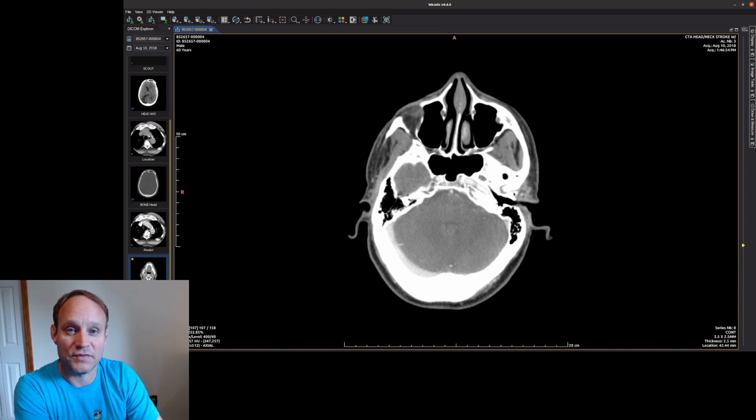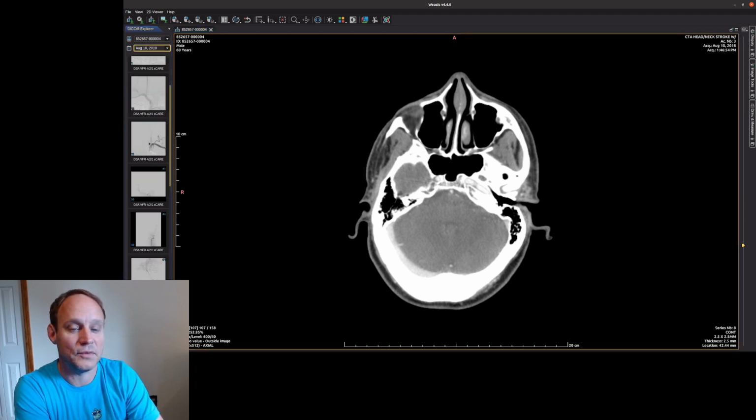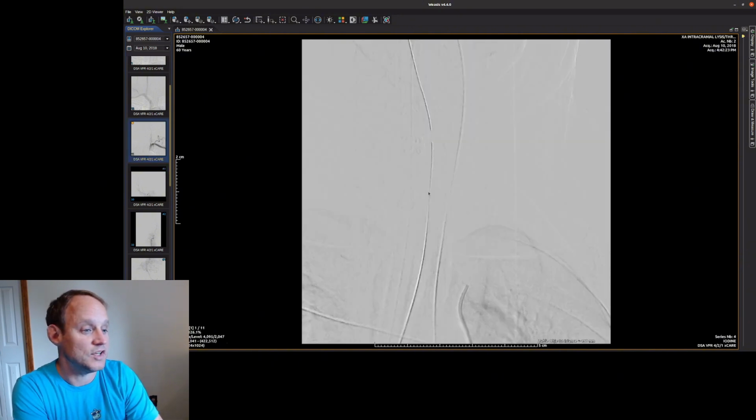About 2 hours after his initial presentation, he was found to be unresponsive, not moving any extremities, actually lost his corneal reflexes. So I was contacted again and told them to bring him to the angiosuite. He was intubated before that and then brought.